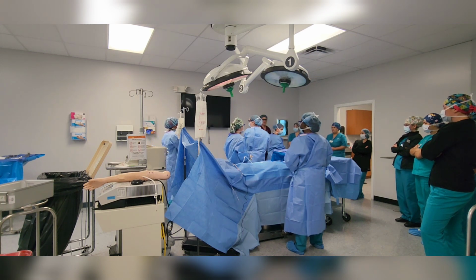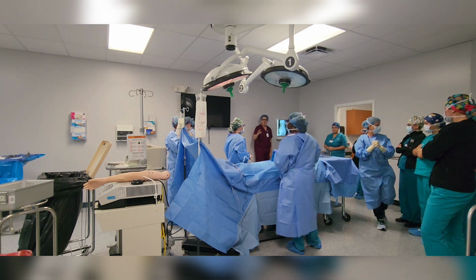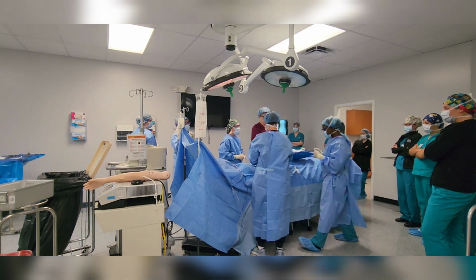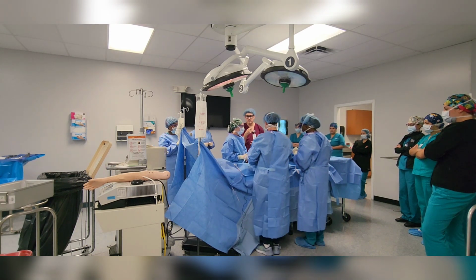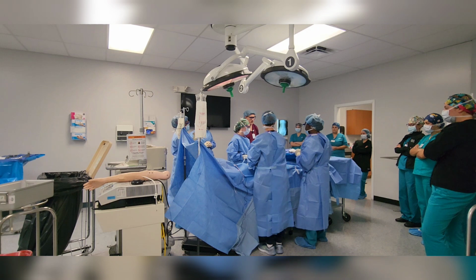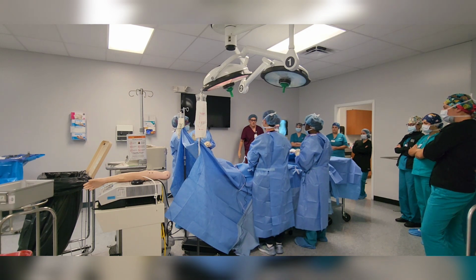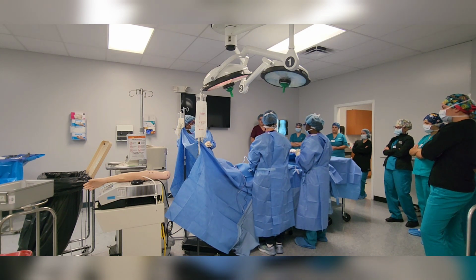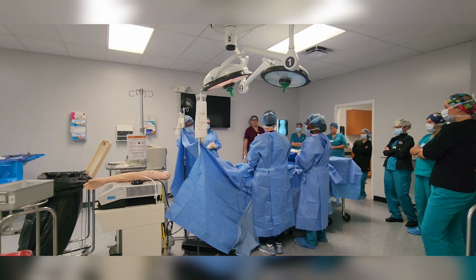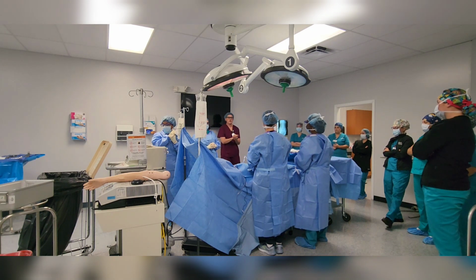So the whole idea is I want you to just get used to this. She's going to ask for some things, and just make sure you're handing that properly to her. Okay, this is yours. I want you to own it. Just assume you had some information. Stand right there. What do we do first? Marker? Nope. What do we do first? Time out. Okay, everybody stops. We have a circulator. Would you like me to do a timeout? Yeah. Let's do a timeout.